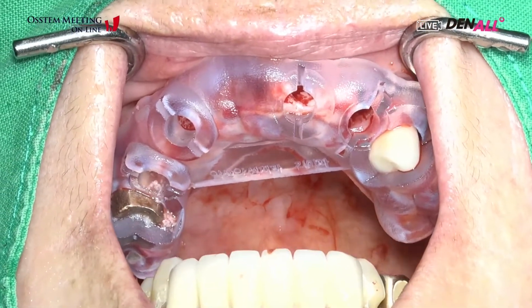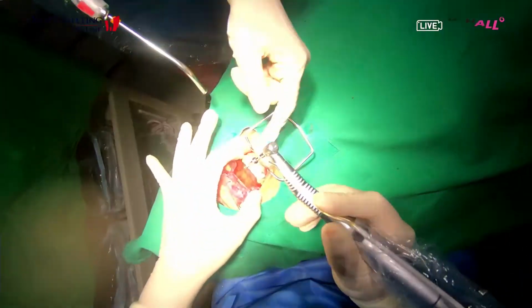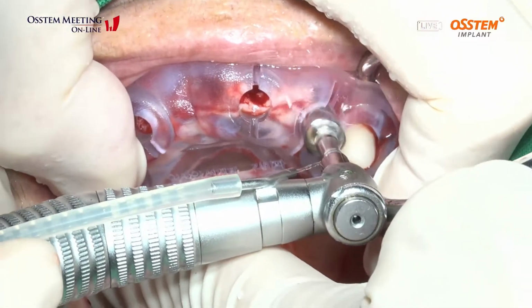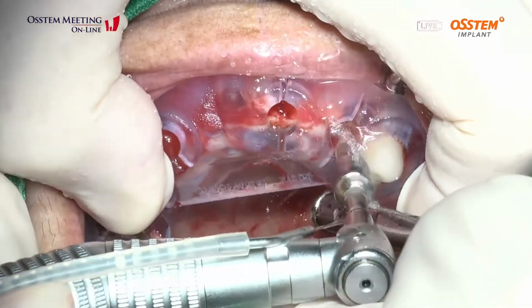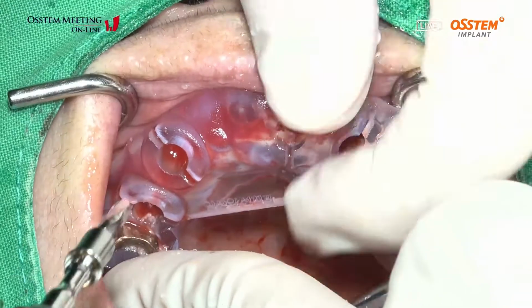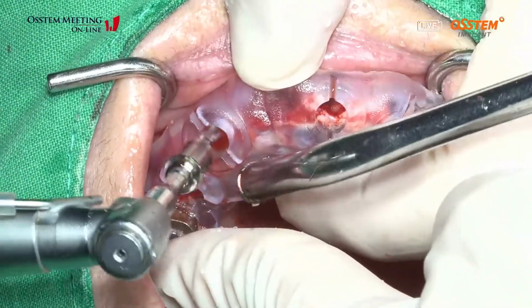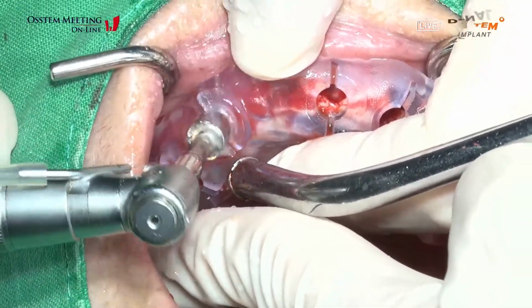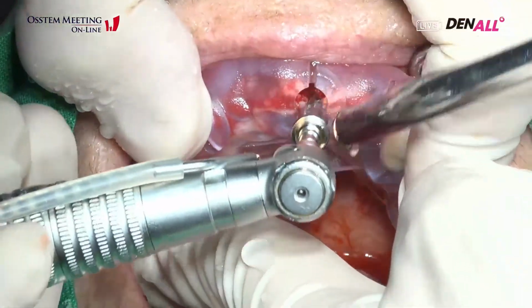So this is a 3.5 by 10 OneGuide drill. And then canine. The central incisor.